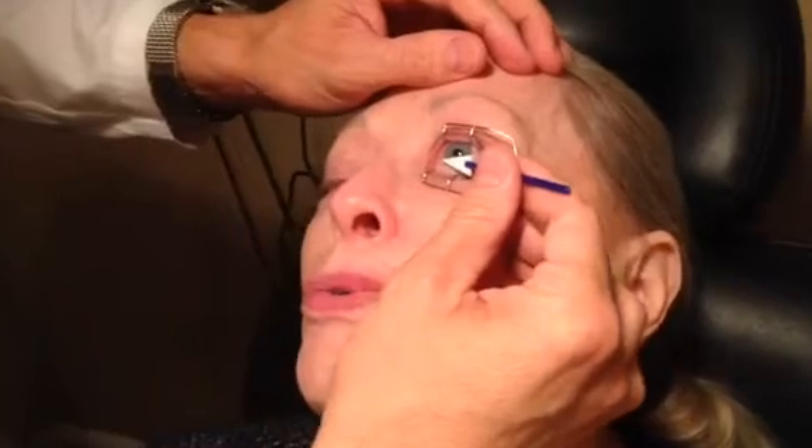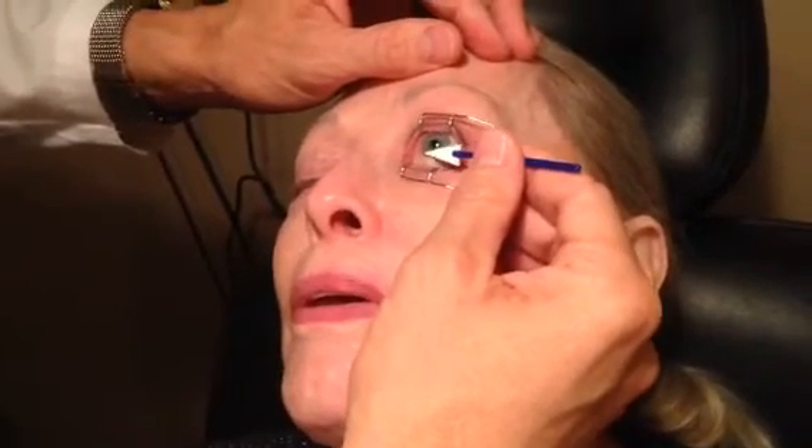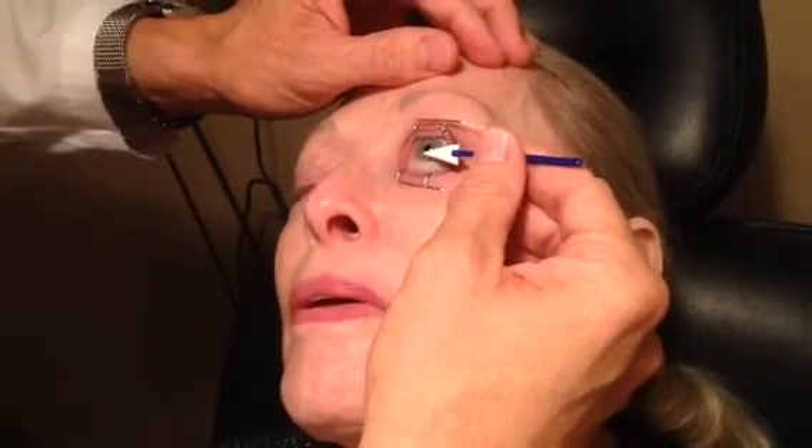Now when you try to blink, it's like you're blinking, but you're not, okay? Hang on there. Try that little area. Yeah, you're doing wonderful. I'm not doing as well as you may think. I know. You're doing well enough for me, okay?